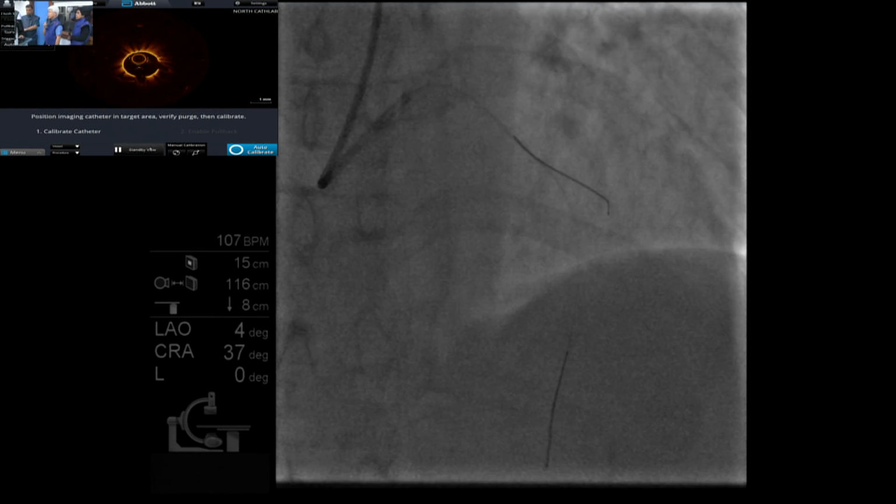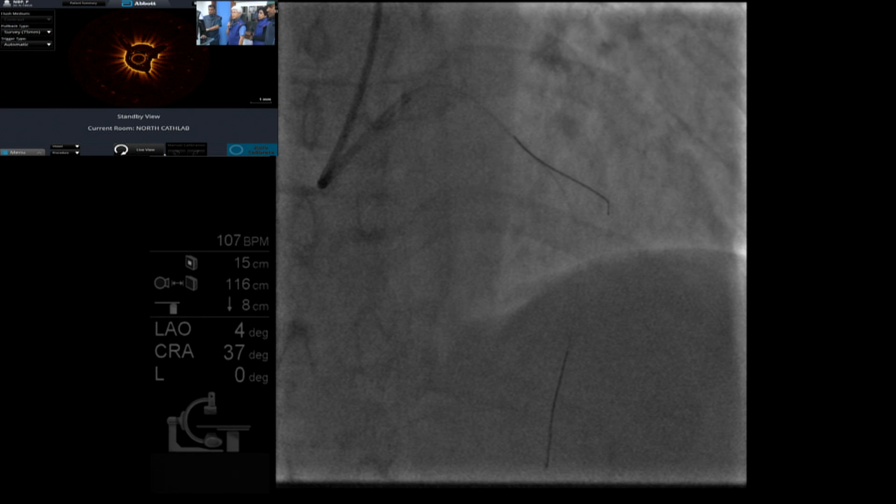So the catheter was occlusive, so you're going to pre-dilate first. Can we take out the side branch wire? Then it is possible. Then it will not be that occlusive.